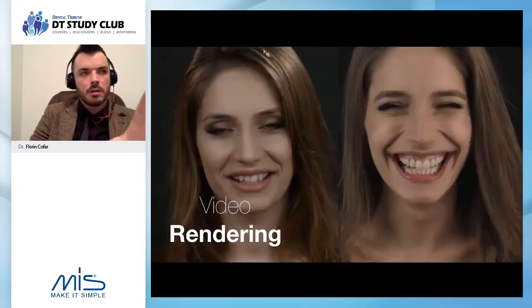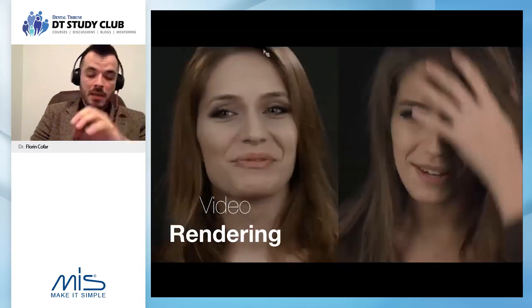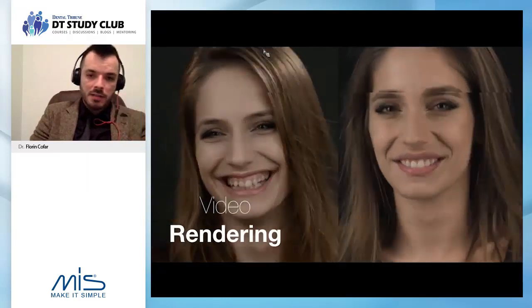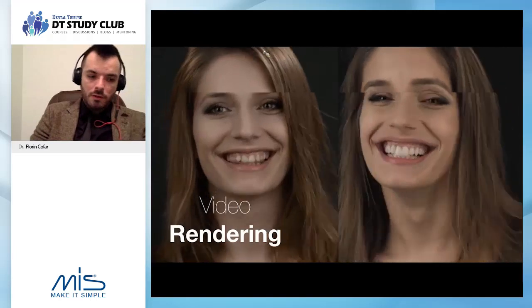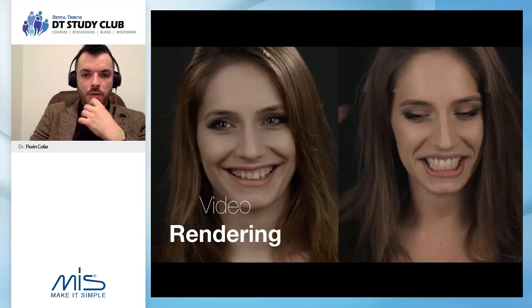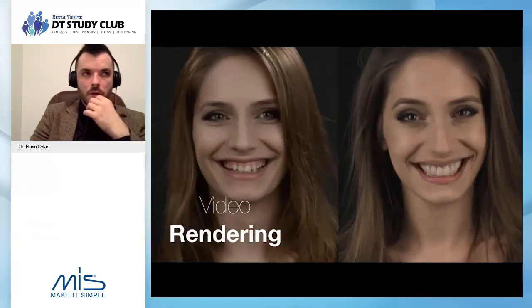This is very important to understand that this is, I think, the best way to present the treatment plan for various reasons. Why? One of them is, first of all, diagnostic wax-ups. Most of them are not additive ones, which means you have to go more buccal. Designs tend to be more bulky, and the only angle in which they look close to reality, or let's say good, is if you show from the front.